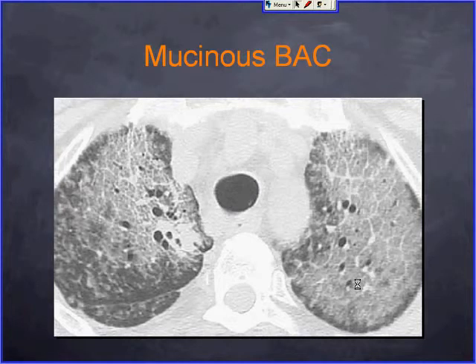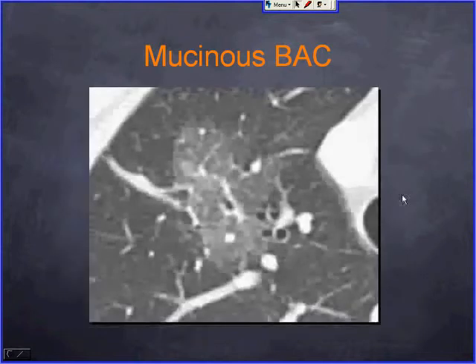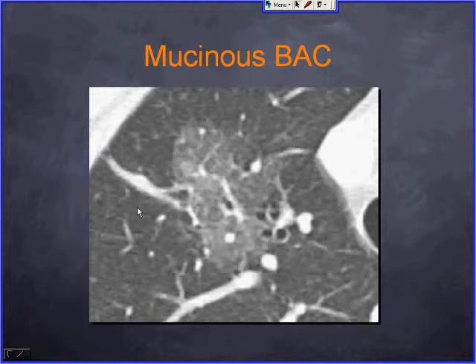Here is a mucinous BAC example: you can see the ground glass opacity, the polygonal-shaped interlobular septal thickening lining secondary pulmonary lobules, and smaller intralobular septal thickening. This is a milder case, but it was eventually proven to be BAC.